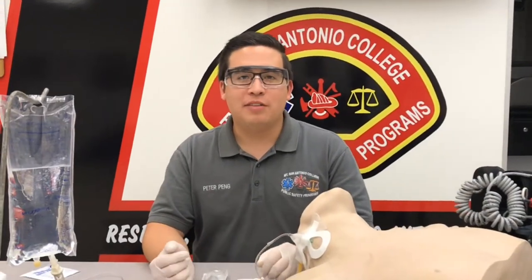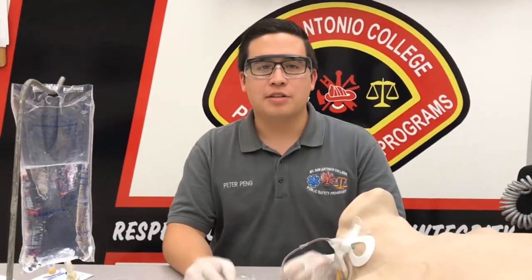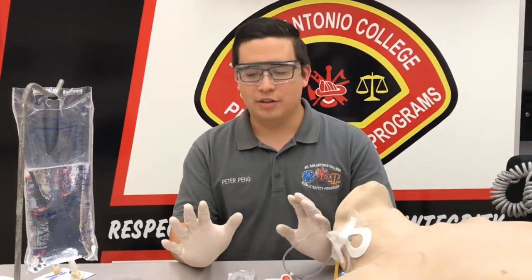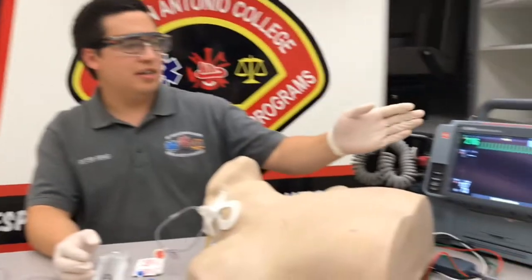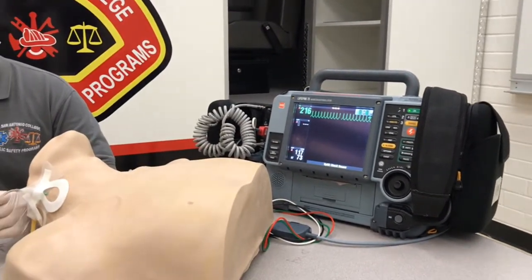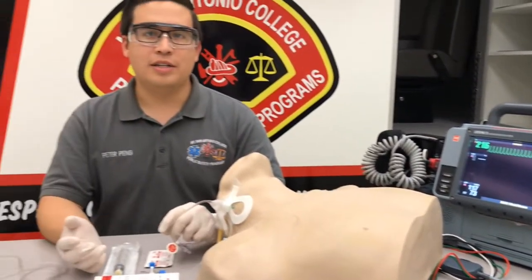I'm going to demonstrate how to do a rapid IV push using adenosine. First of all, we have our BSI on, we have our gloves and goggles, and our scene is safe. With this patient, our patient's in supraventricular tachycardia, and vagal maneuvers have not been successful, so we're going to do adenosine.